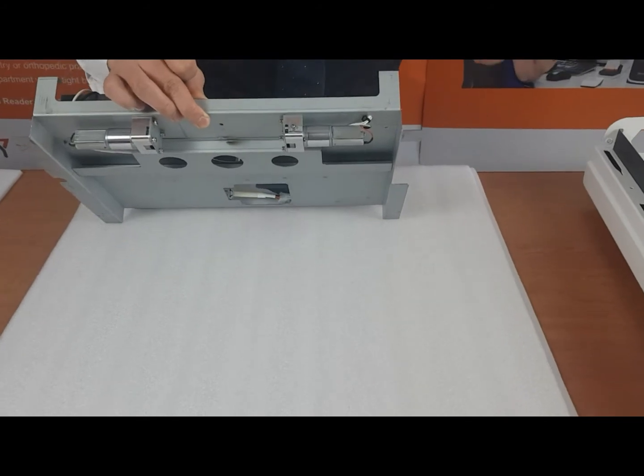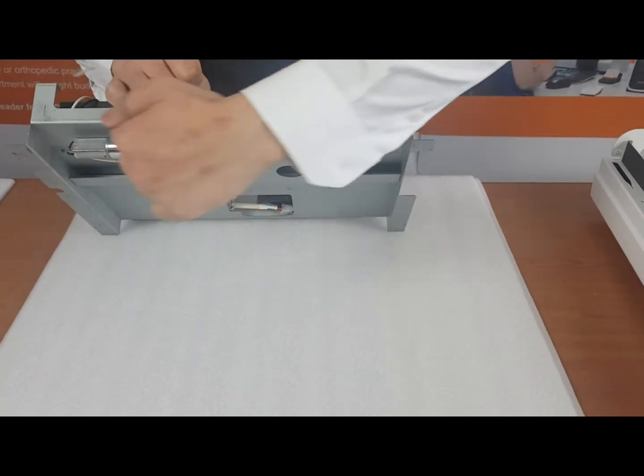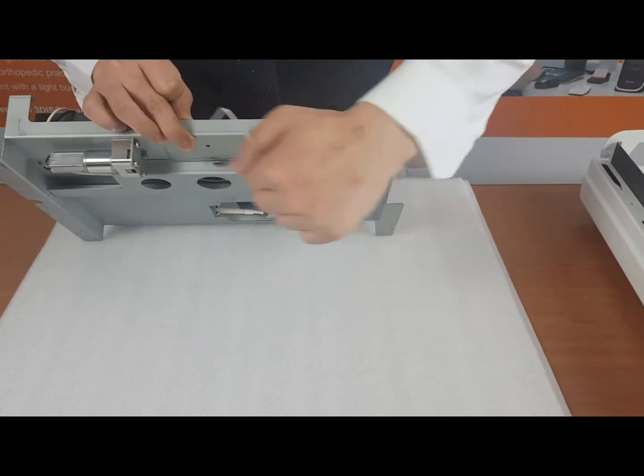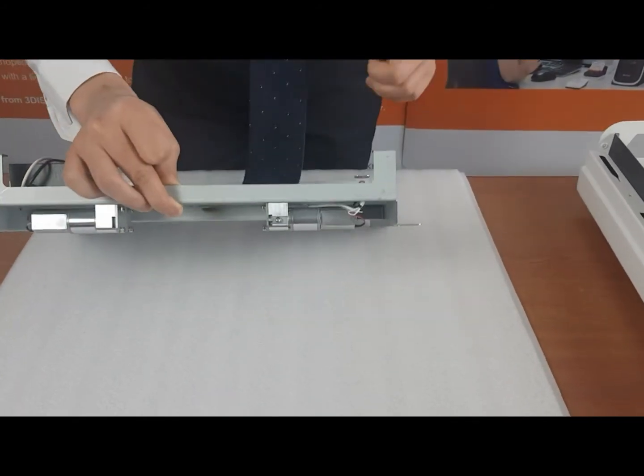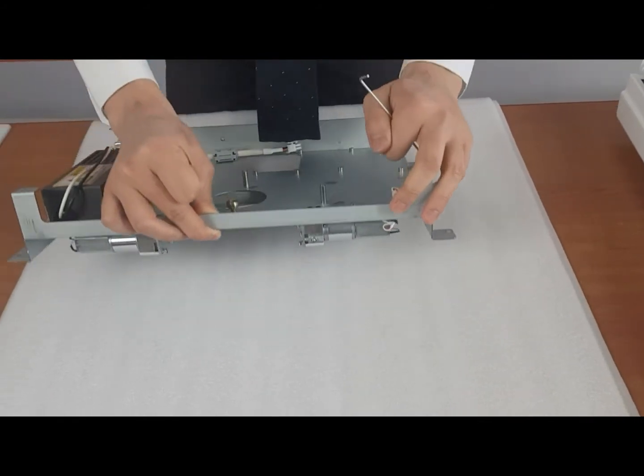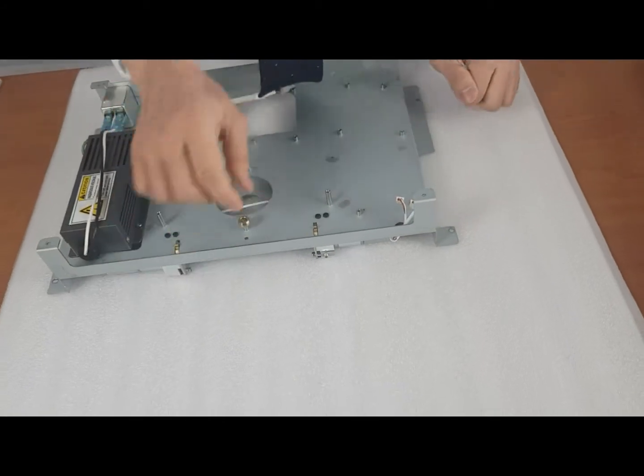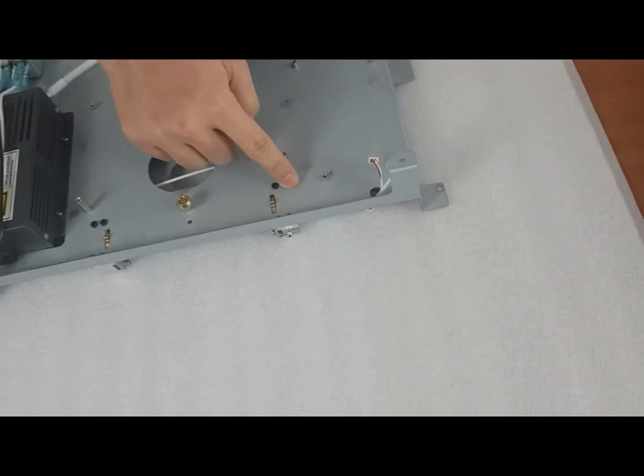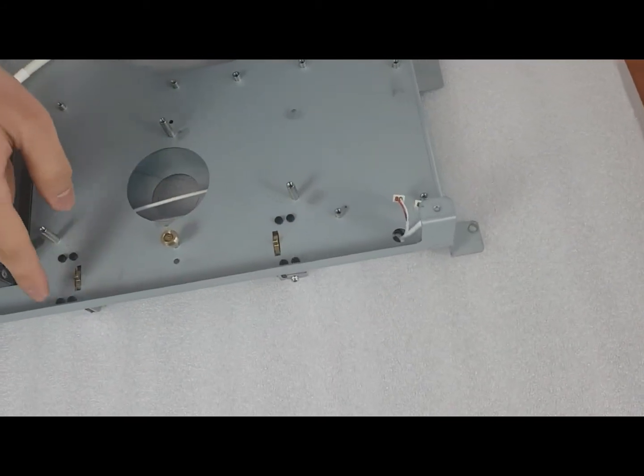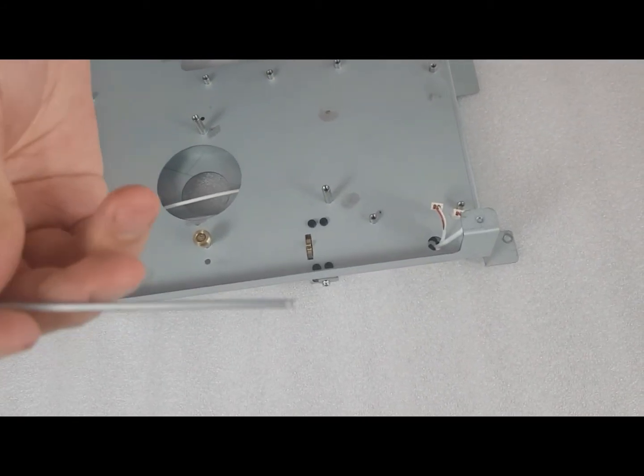So you have to remove both left and right. You have to remove these eight screws using a 2.0 hex key.